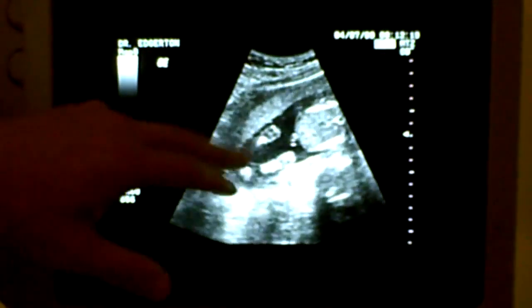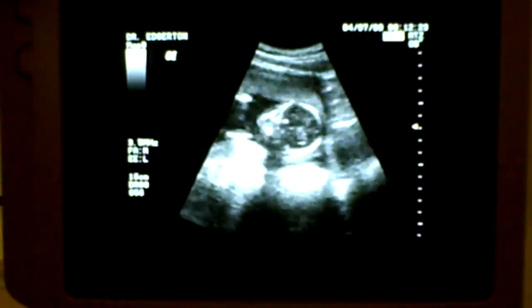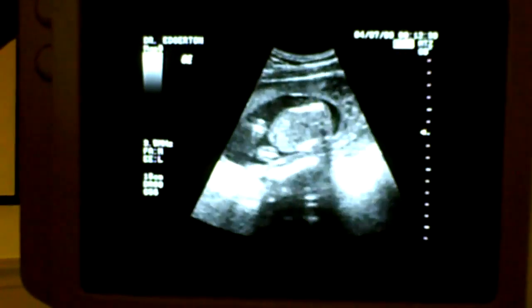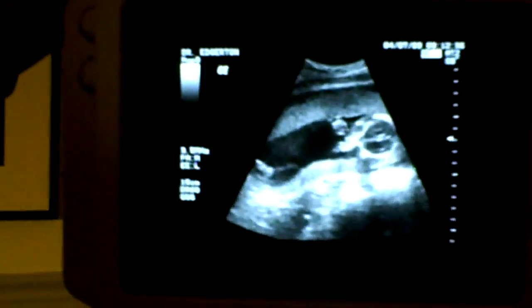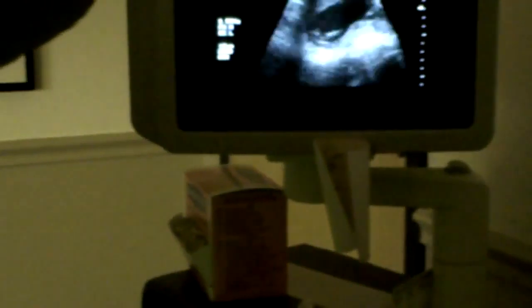Cute little knees and feet there. Placenta looks good. Baby's healthy, moving good, fluid around the baby looks good, heart rate looks great. That's the top of the head — looks like all the parts are there, so that's important. We'll do the anatomy profile on your next visit, and a little bit of blood work today.